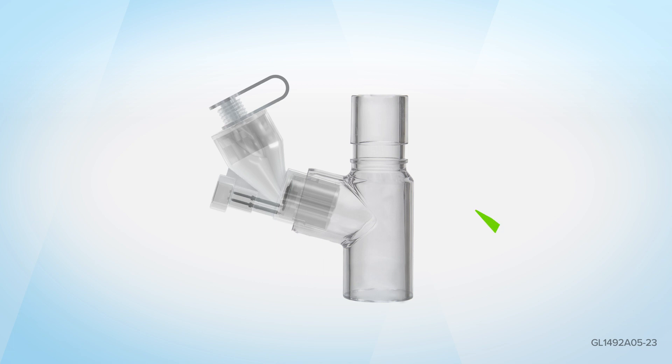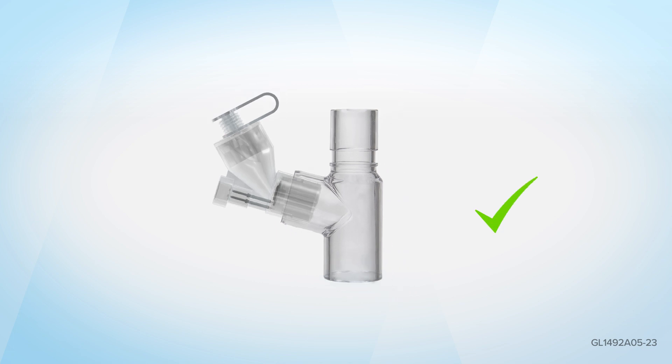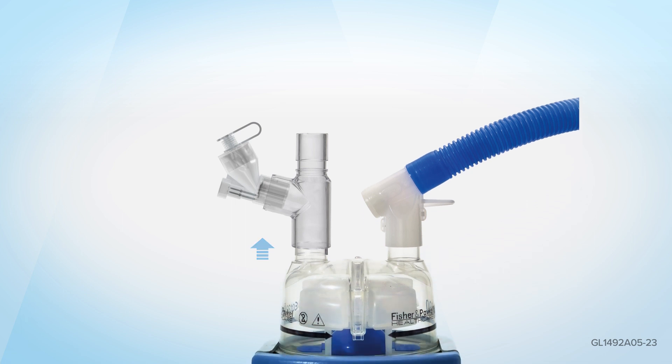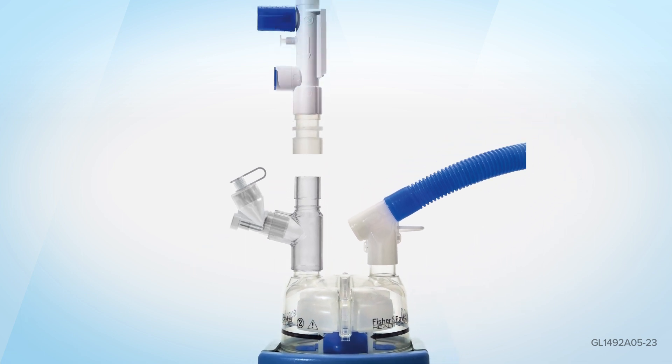Place the Aerogen Solo firmly into the Aerogen 22mm tee piece and ensure correct orientation. Insert the Aerogen Solo and the Aerogen tee piece on the dry side of the humidifier.